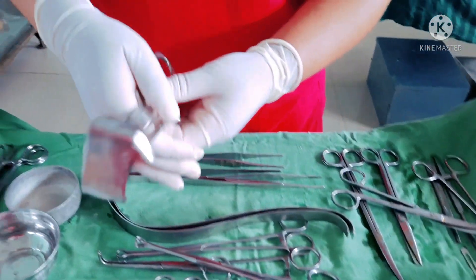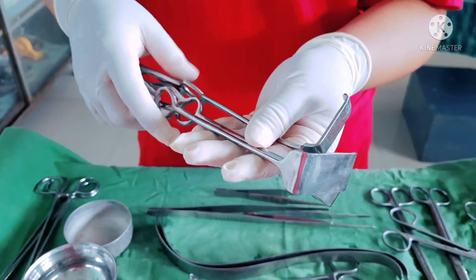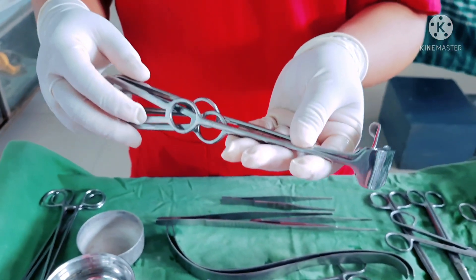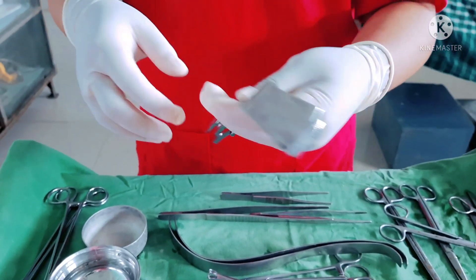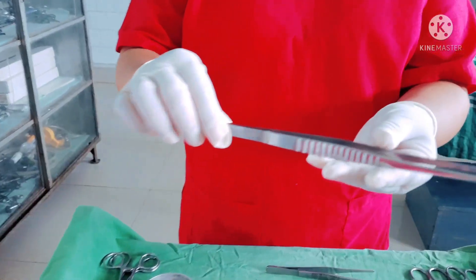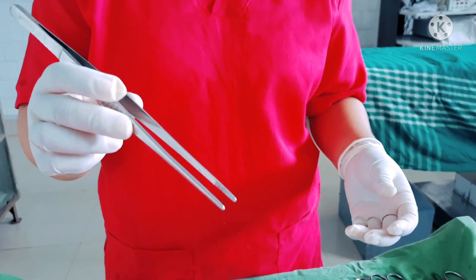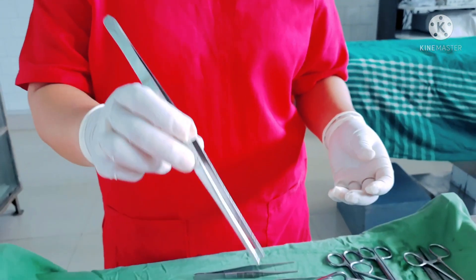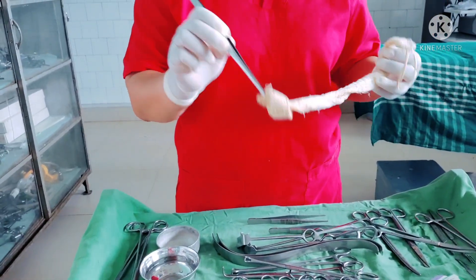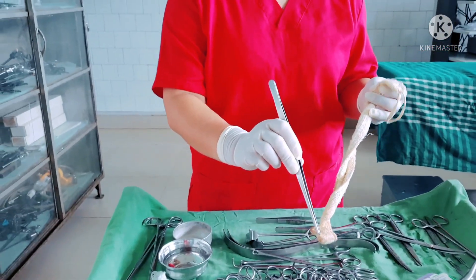This forceps is known as Langenbeck or skin retractor. It is used in superficial retractions of the skin and muscles during the operation. This instrument is known as long jaw forceps, mostly used after opening the peritoneum area inside the cavity for many purposes — for example, fixing of the free gauze inside without using the hand.